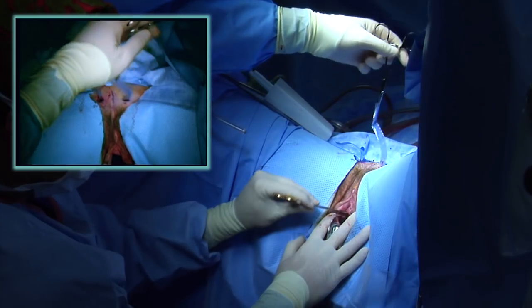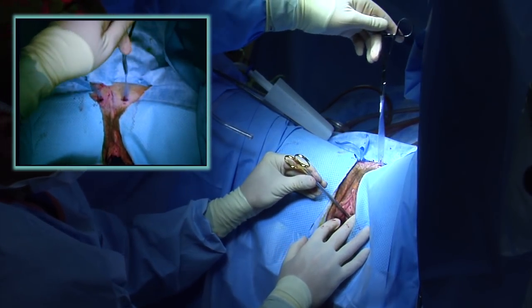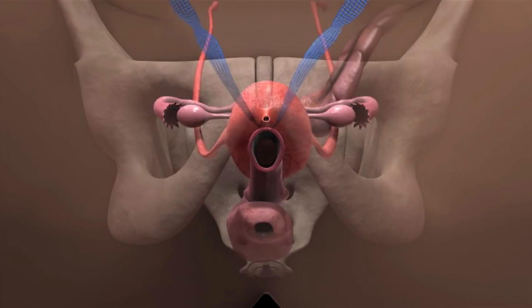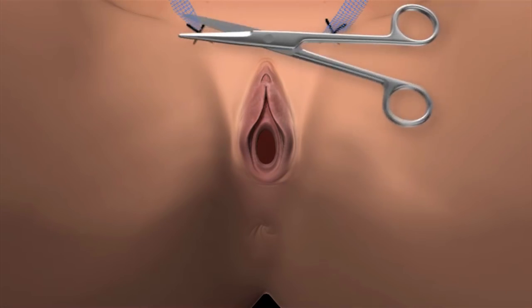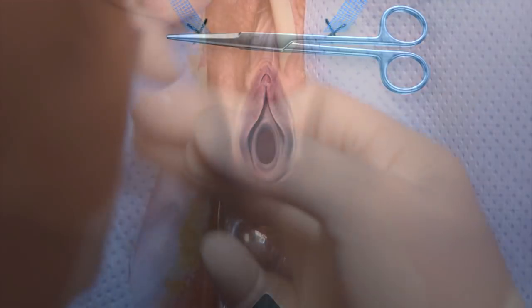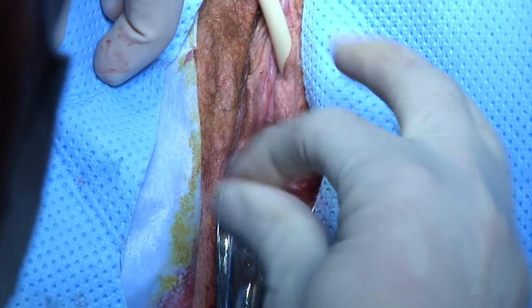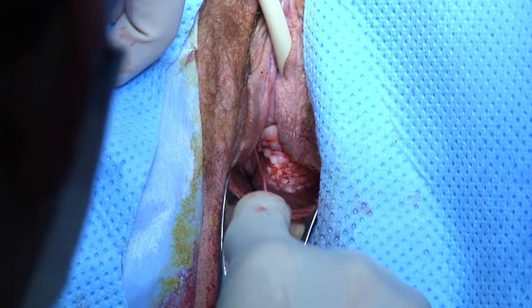Carefully remove the plastic sheaths surrounding the Prolene mesh. If needed, make any final implant adjustments. Cut the ends of the implant just below skin level and close the vaginal and abdominal skin incisions. This concludes the Gynecare TVT Exact retropubic procedure.